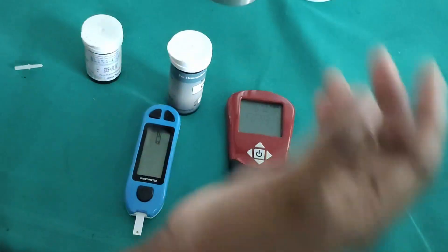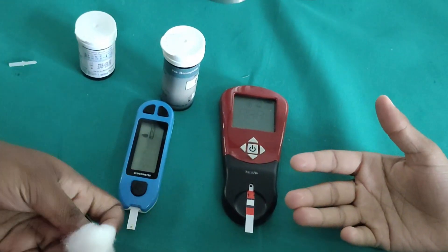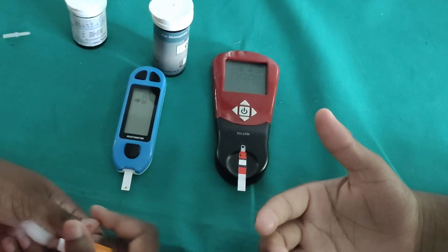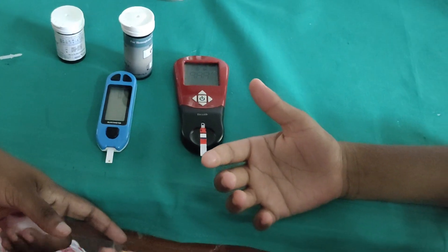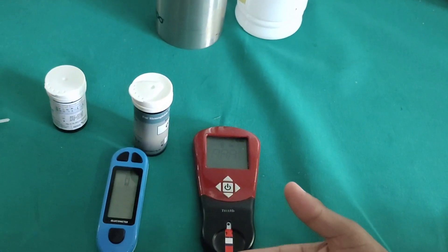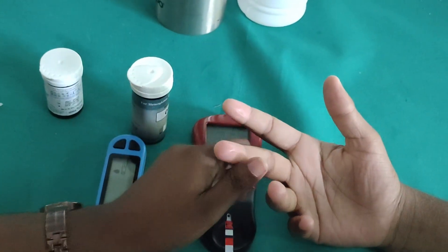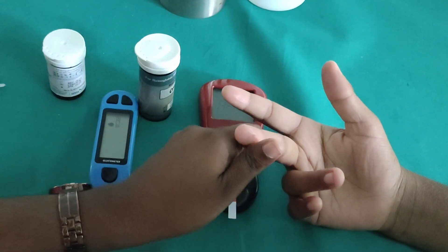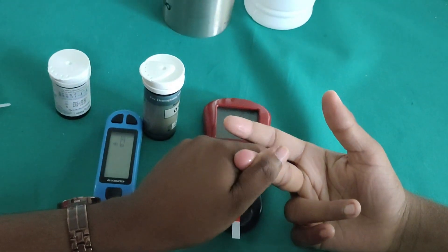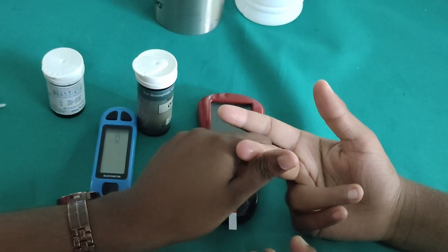We take the patient's hand and explain to him that we are going to check his blood for HB and RBS. So I am going to collect the patient's blood for both the RBS and HB tests.